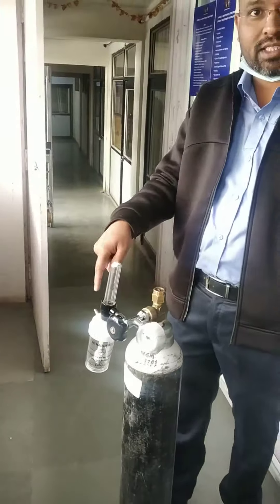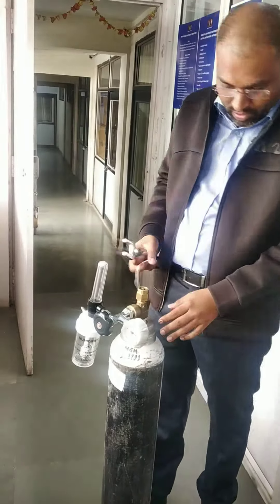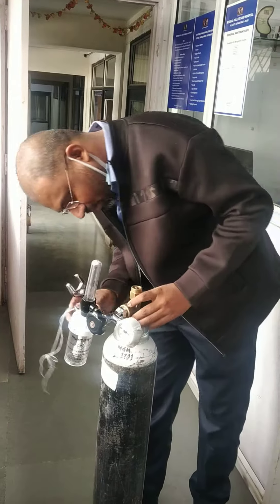This is an oxygen cylinder and this is the humidifier side. You can see the marking here.